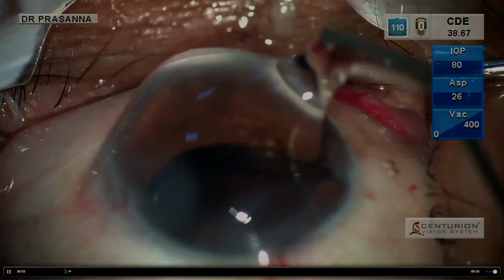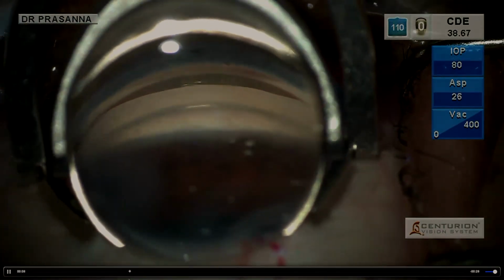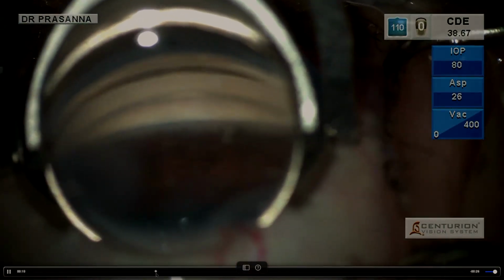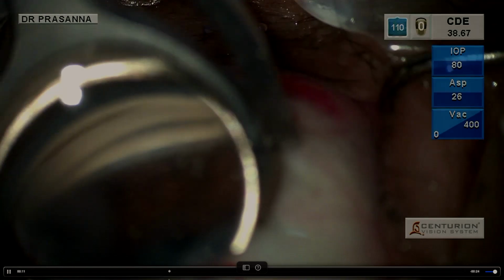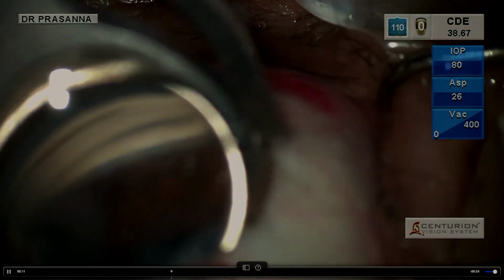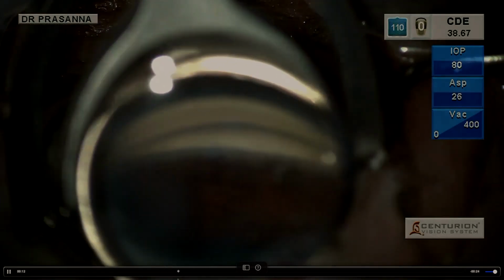You can see that sometimes I use only a simple HPMC. This is a simple HPMC, but see how the docking happens, just like an indirect gonioscopy on a slit lamp, and you see how you can move the eye with the lens. This is a blocked eye. You can see on the right hand side there is a block that has been done. But despite the block, it's actually very difficult to move a blocked eye with a direct gonioscope.